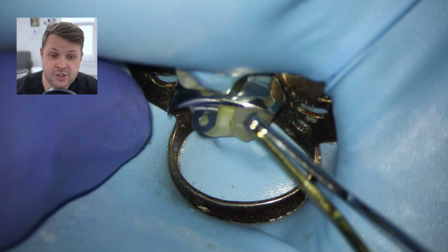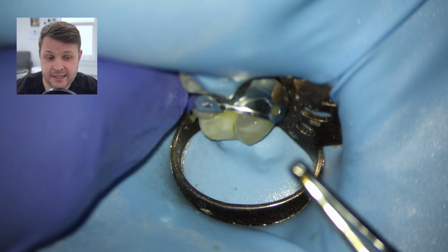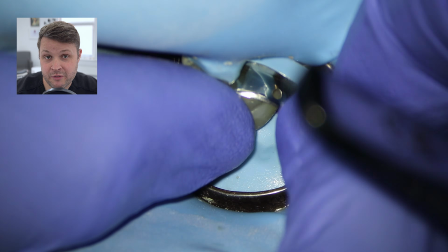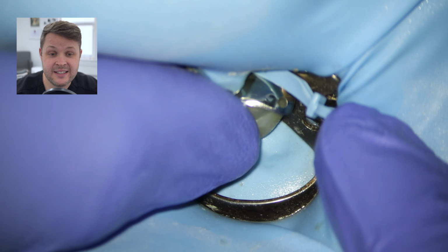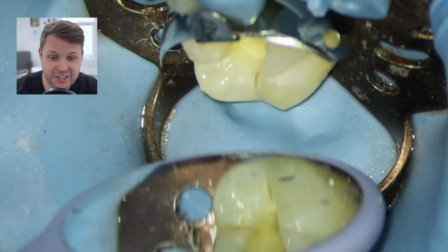And I'm going to use a sectional matrix here. Weirdly enough, in this practice, I use Palodent, but more and more often now I'm using more of a Garrison set. I feel like that's a better sectional matrix. But, you know, we work with what we've got in the practice that we work in.